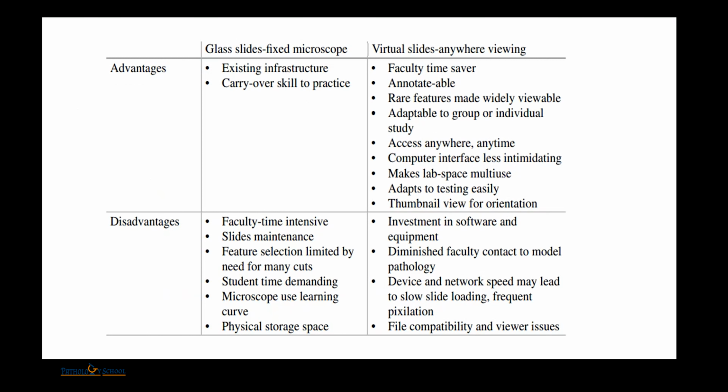Next, what are the advantages and disadvantages of glass slides and virtual slides? In glass slides, we already have an infrastructure. We need only the skill to practice. Whereas virtual slides are accessible to us anywhere, anytime. So it is a faculty time saver. You can annotate these areas, and rare features you can view them again. We can view them in a group or individually. And the computer interface is much less intimidating for everyone.